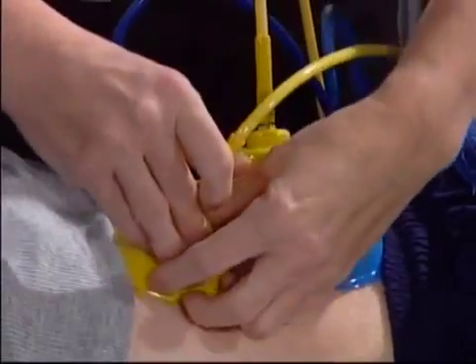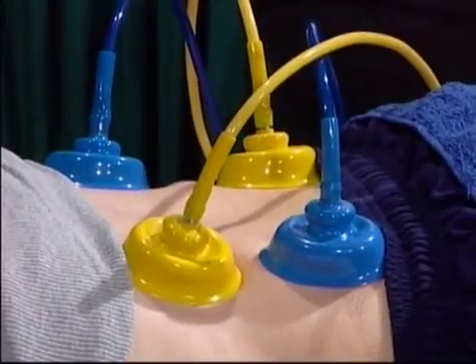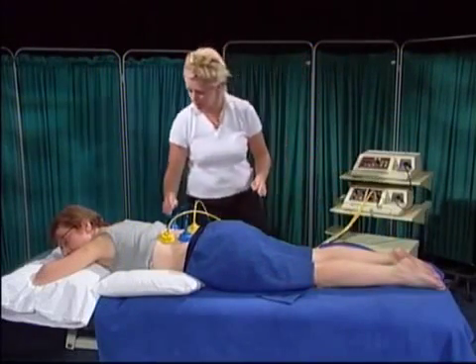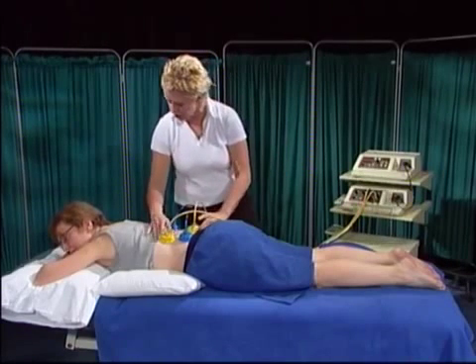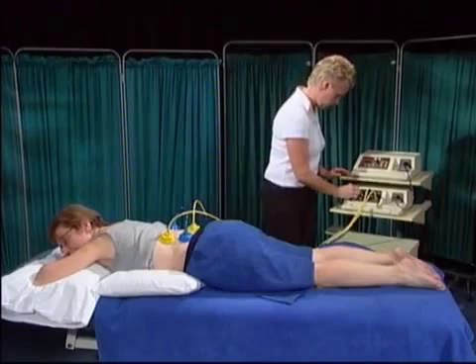In tandem with research evidence, electrotherapy use requires skilled clinical decision-making as to which modality to use and when. Used in the wrong situation or using the wrong dose can be ineffective, or at worst make a patient's condition deteriorate and may even be dangerous.